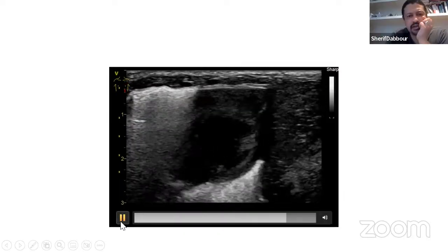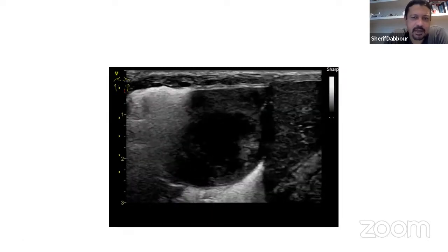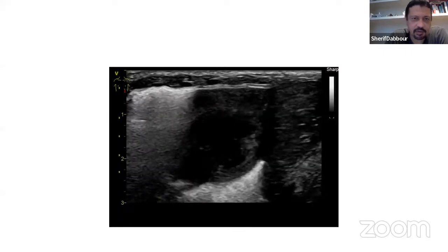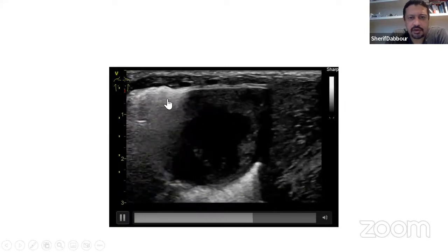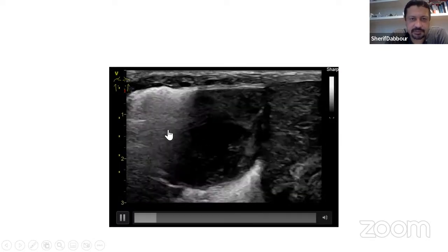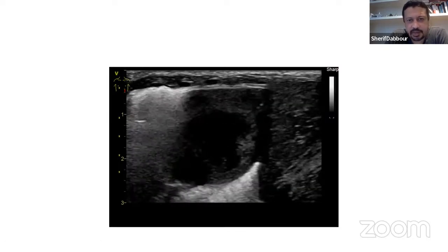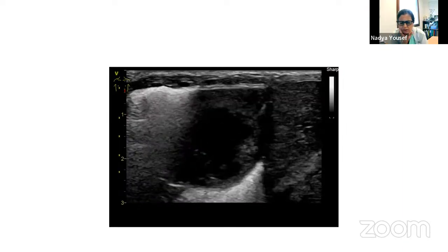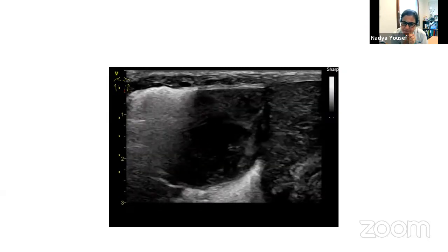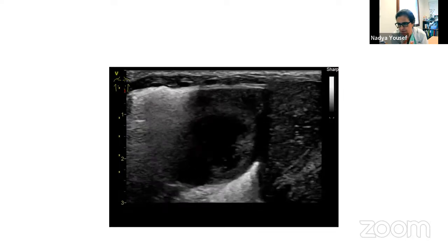And then this is L2. I could appreciate that the pleura is sliding, and there is still subpleural consolidation. I could see some A lines, but it's mainly B profile on the upper part of the video here. So there is a double lung point here, because I can't see A lines on this part. I could see an A line here on the right side of the video, but again, it's mainly B profile. I wouldn't use the term double lung point, because you don't really have 2 different patterns. Double lung point is when you really have 2 different patterns with sliding, and here you have different degrees of severity of the same pattern. So I wouldn't use that. Okay.